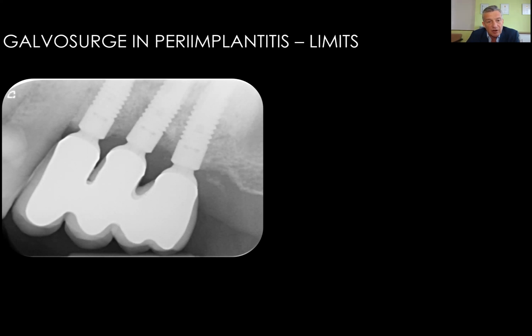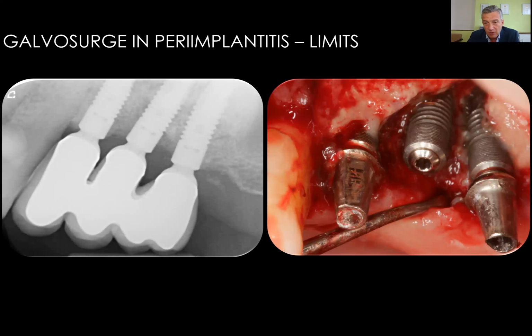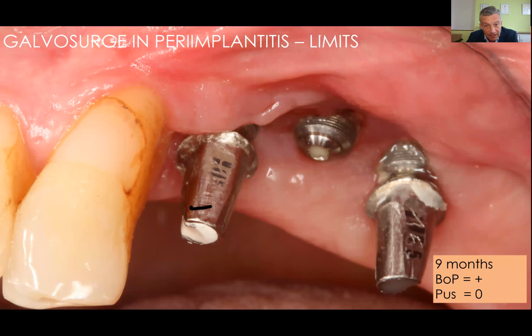I don't want to share only the nice cases. This is one of our worst. When I saw the situation, misplaced implants and a huge defect, I suggested to the patient that I could clean the implant, maybe augment it, but the misplacement would still be an issue. I said, let me remove those implants, but he didn't allow me to. So I cleaned it and treated it. And this was a bad outcome in our study.